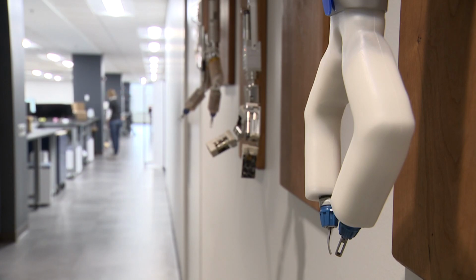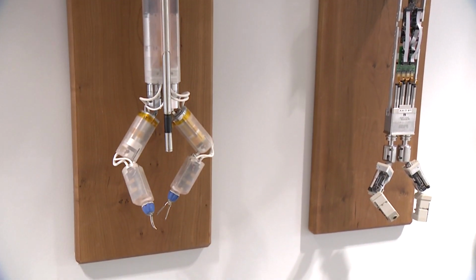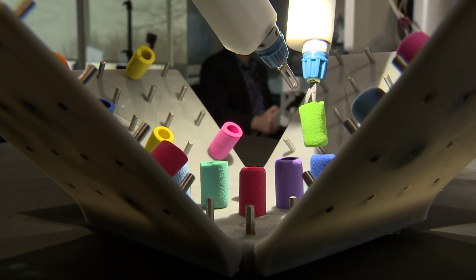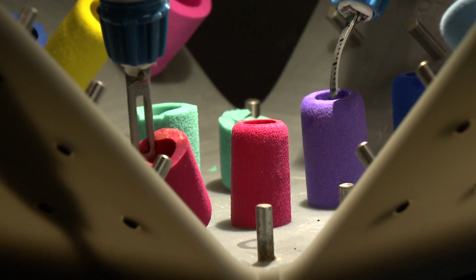Consider this wall the evolution of an idea, an inventor's showcase with space to spare. Our learning is in the doing. Shane Farritor, an engineering professor with the University of Nebraska-Lincoln, has been building and researching small robots for surgery for the last 20 years. And since our robots are small, they have this advantage that they could be used in remote locations. So the first thing I think of is rural places in Nebraska that there's a lot more hospitals than there are surgeons.